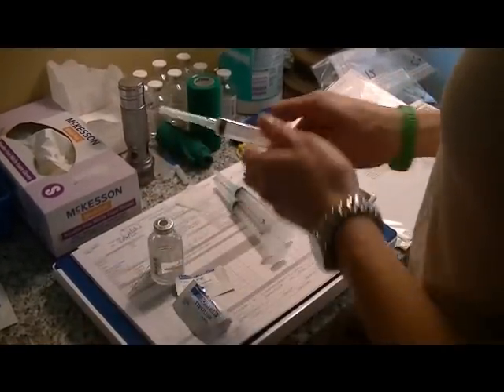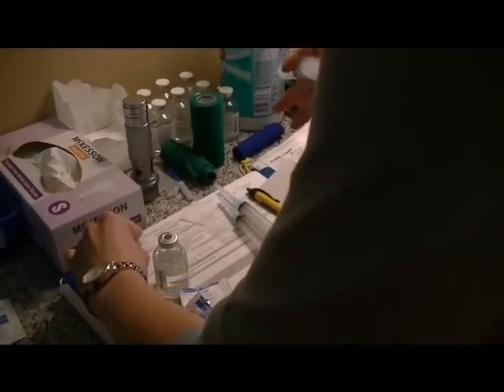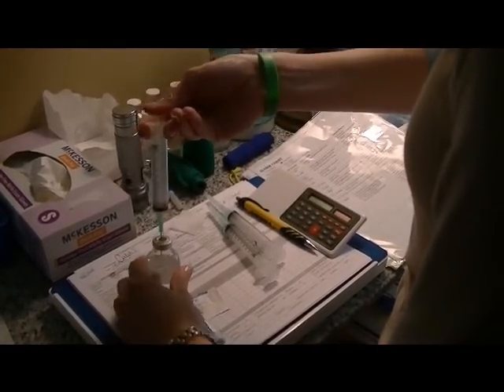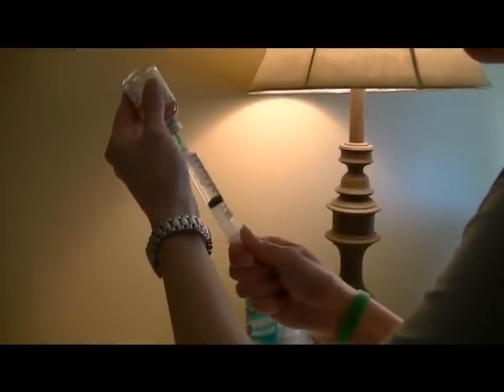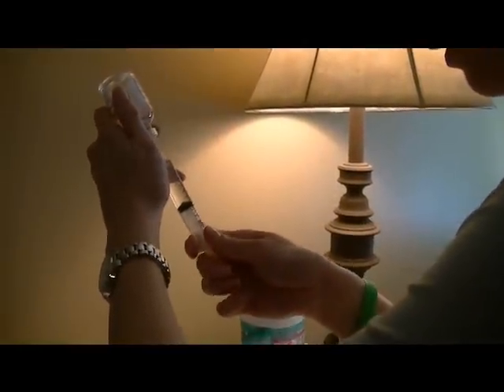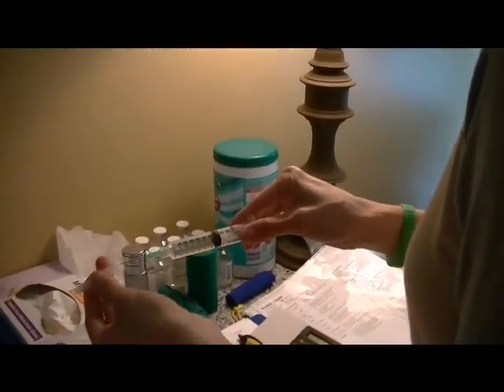Now we're going to draw up the heparin that we use to help so that he doesn't clot while he's on the machine. We're just going to draw it up, get all the bubbles out, and put it over here.